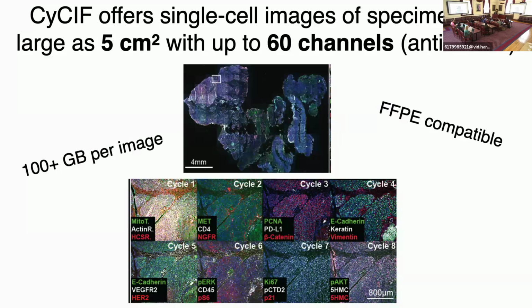Just to follow up on this one. So the main limit on the number of channels is tissue integrity? I would say so. Okay. But it is definitely the case that depending on your biology, what you're studying, and available useful antibodies, you start to run out of those too. And is it then that measurements of later channels are kind of worse and you need to somehow normalize for that? We absolutely do.